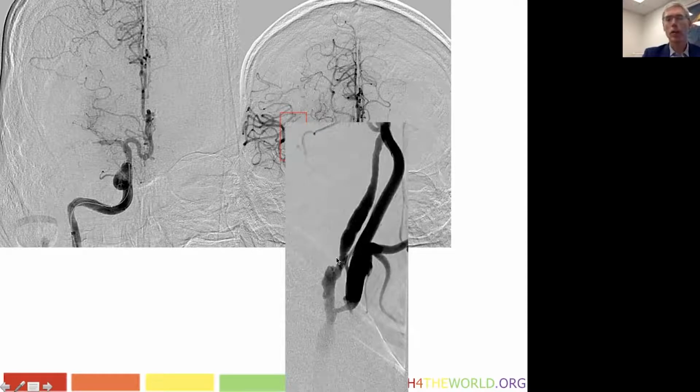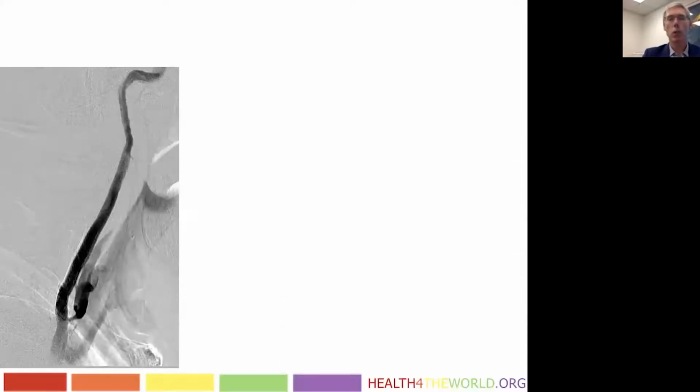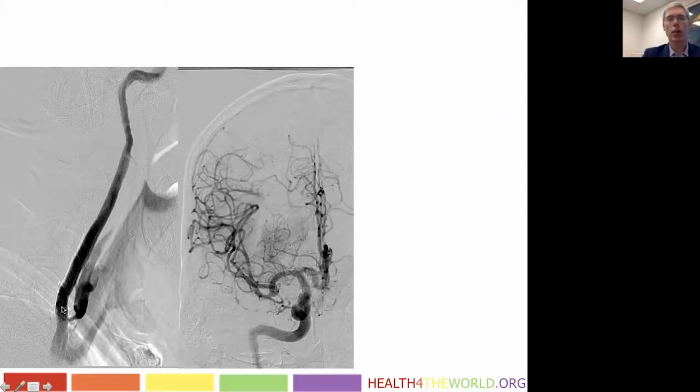But now we had to address what's going on in the neck. And so this patient has atherosclerosis, a long segment atherosclerotic plaque. And to be conservative, because the patient received IV TPA, we don't want to have to put a large number of antiplatelet agents on these patients initially because they're in this acute phase, to try to reduce their symptomatic hemorrhagic rate. We just did angioplasty conservatively. We then waited a couple days, loaded the patient with dual antiplatelet, brought her back and stented the internal carotid artery. And this is what her vessels look like just a few days later.